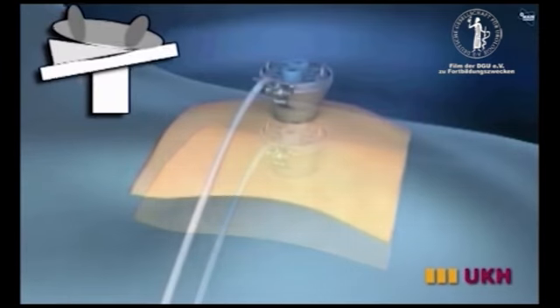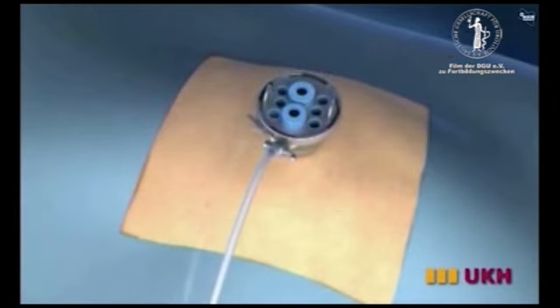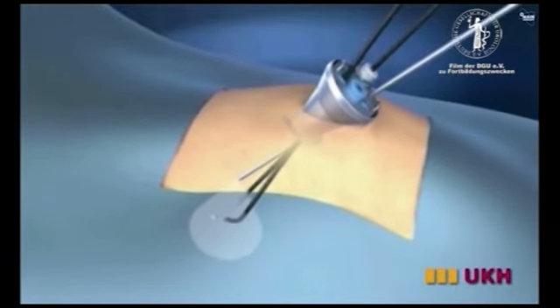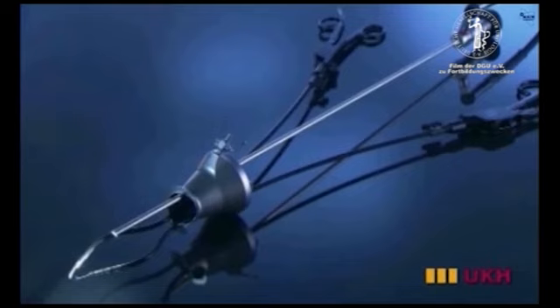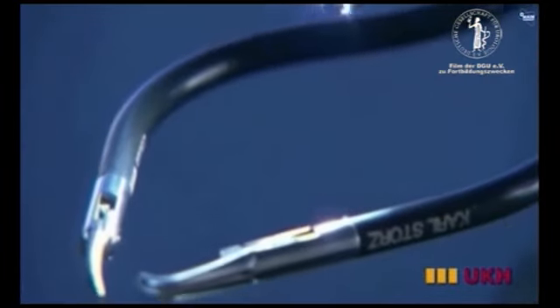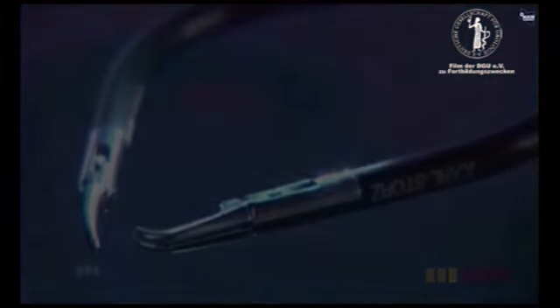After the placement of the trocars, the patient is rolled for a total of 60 degrees. In our procedures, a combination of bent forceps and conventional straight laparoscopic instruments is used. The instruments are inserted through one of the 5 mm channels and through the 12 mm channel of the last port.